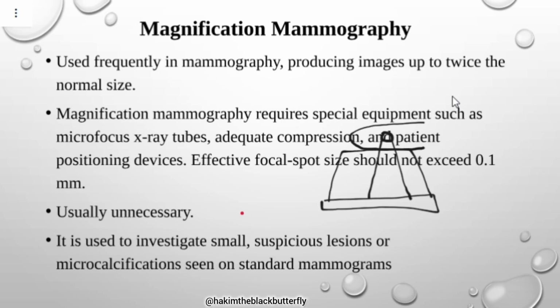Like a patient who cannot sit, but just remains lying down. The machine is designed for a patient to sit or to stand. But now we are saying, what about a patient who cannot sit nor stand? Then that patient cannot qualify for mammography, because it needs you when you're sitting or when you're standing. So if you are bedridden, then there's no need for mammography, because there's no way it's going to be done.